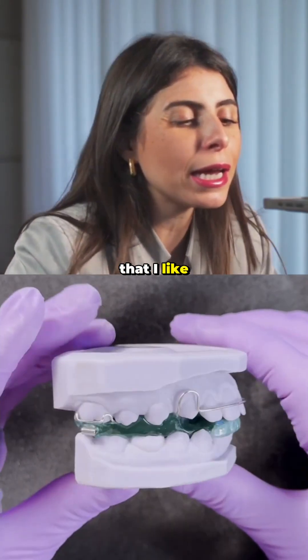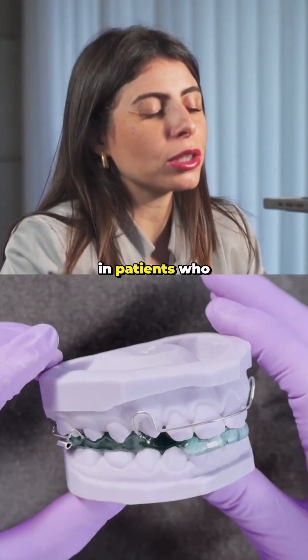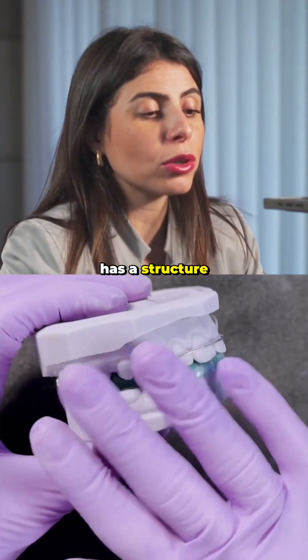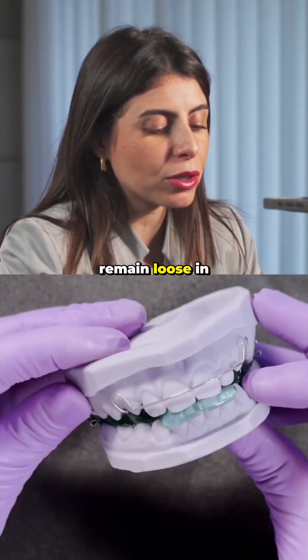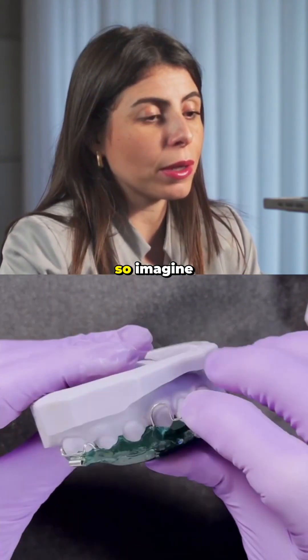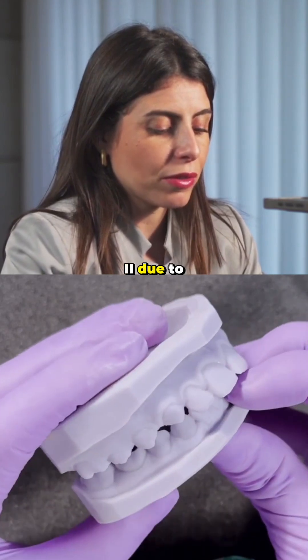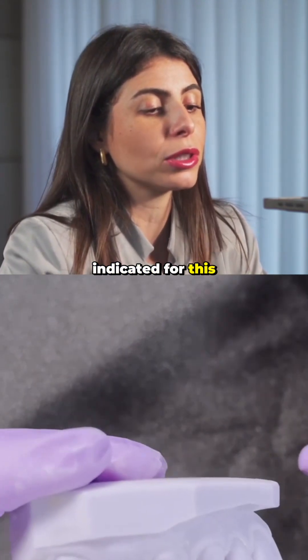This is one of the appliances I like the most for treating Class 2 with mandibular deficiency in patients who have skeletal problems. The Andresen Activator has a structure that encourages the patient to use the appliance because it doesn't remain loose in the patient's mouth. Imagine that your patient has an increased overjet, Class 2 due to mandibular deficiency — this appliance is indicated for that use.